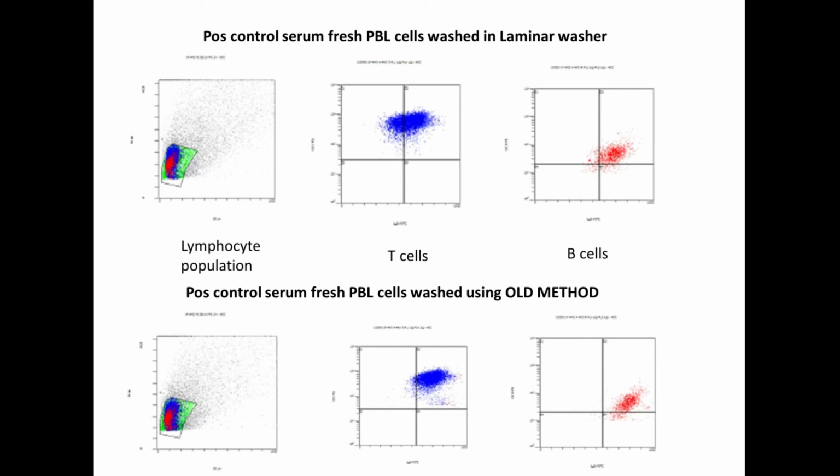And this is why a crossmatch is the most important test before conducting an organ transplant. Our lab at Montefiore currently performs crossmatches for kidney, heart, lung, and pancreatic transplants.